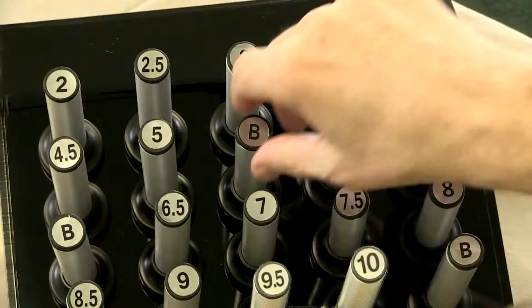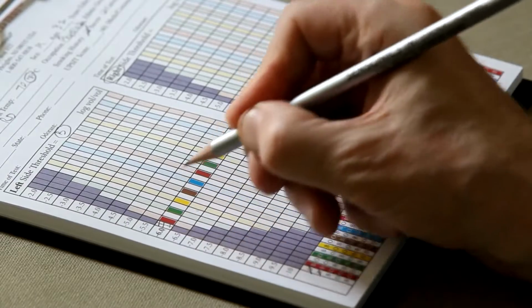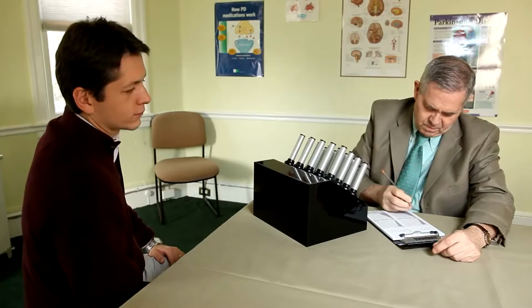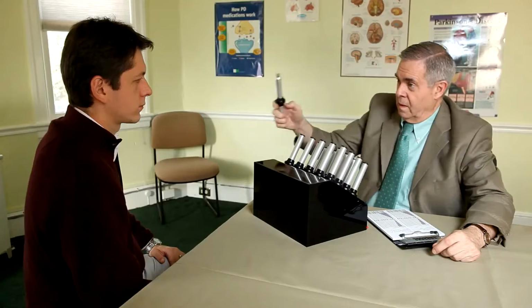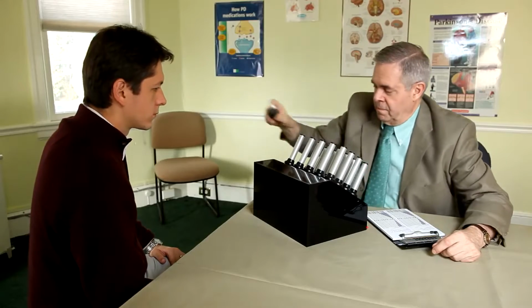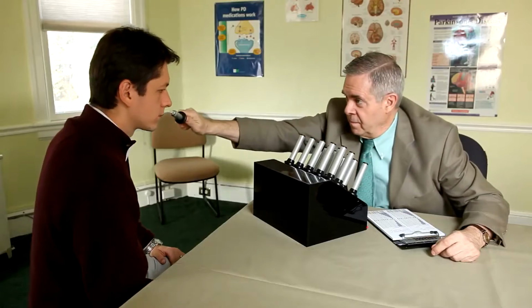First one. And the second one. The second one. There's the first one. And the second one.